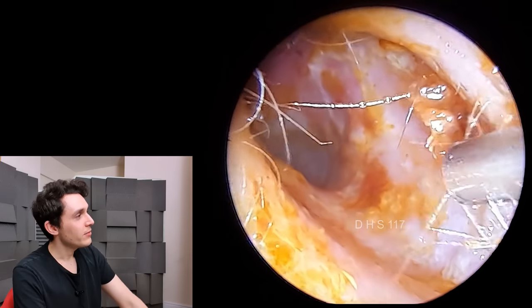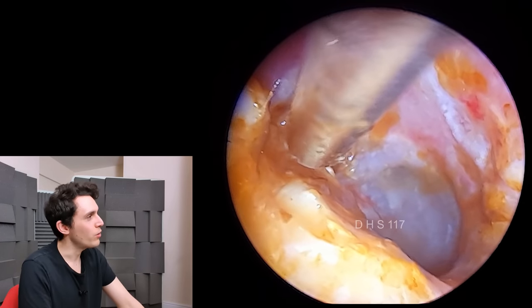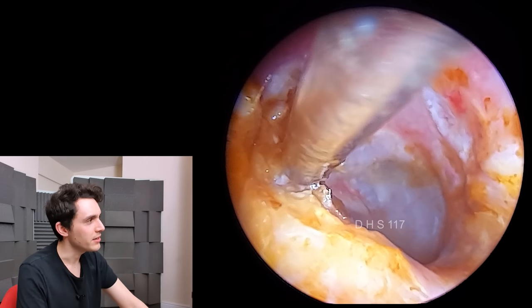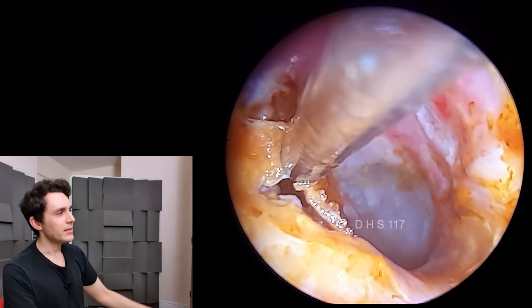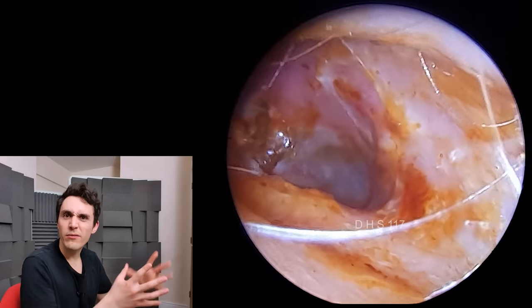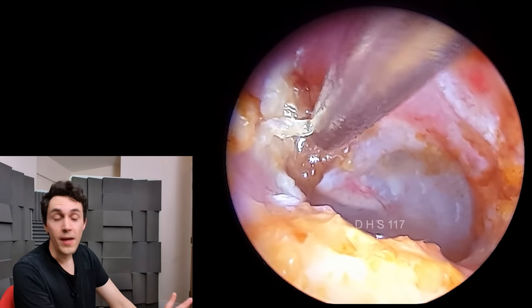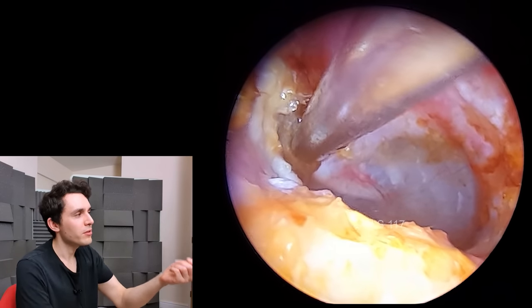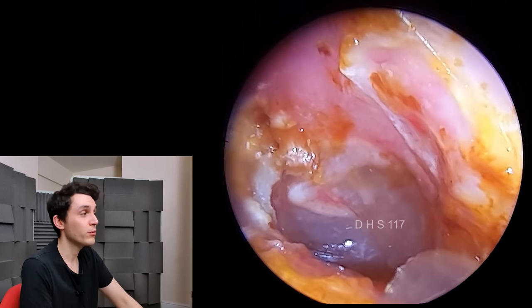You can now clearly see the eardrum back there. See that little bit of ulceration on the right hand side — that little pink area. The term ulceration just means discontinuity of the skin, so it's probably a little bit of bleeding underneath the skin. The eardrum is there — a lovely bluish-gray color. Overall, compared to some cases I've seen, the ear canal actually looks pretty good. There's no obvious swelling, which is edema — pooling of fluid in the tissue — just a little bit of inflammation maybe. Whenever you see pale whitish or brown debris above the eardrum, which is what we call the attic region, suspicions are always raised, because that's sometimes a sign of cholesteatoma, or atticoantral disease.